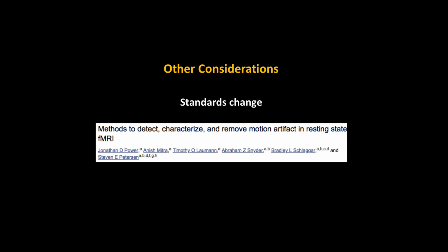And if you do resting state, he's a researcher you should really be familiar with because he focuses on this stuff very, very closely. And something that he noticed was that even if you did things like interpolating volumes which seem to have too much motion, even if cosmetically it looked like it fixed the problem, if you looked at the properties of the signal versus the noise, the interpolated volumes seem to have a lot of the properties of the residuals as opposed to the actual signal. So cosmetically, it seems to fix everything, but if you take a deeper look, it actually doesn't, unfortunately. So that's a good paper to look at.